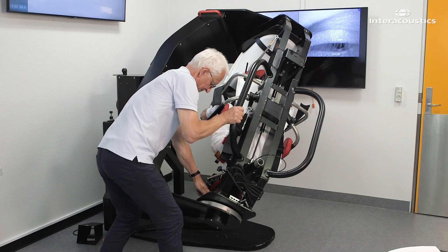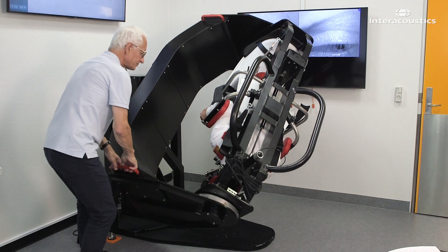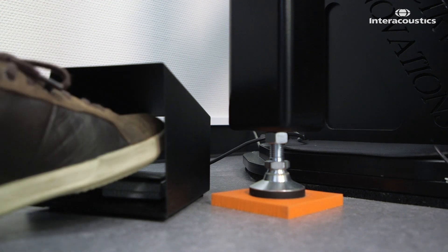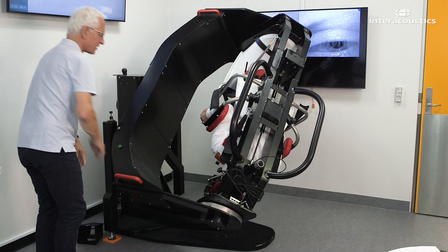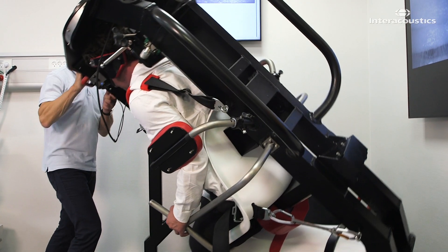In the fifth and final position, the affected posterior canal is pointing straight towards the ceiling. Hold the patient in the final position for 30 seconds before returning the patient to the upright position.